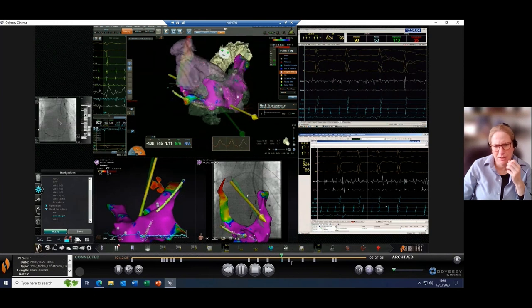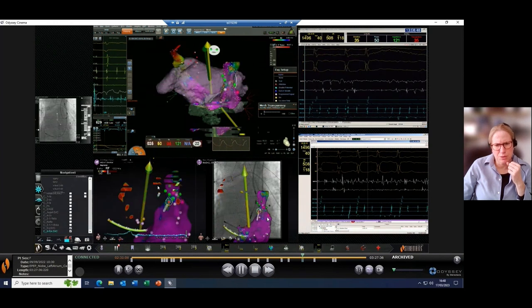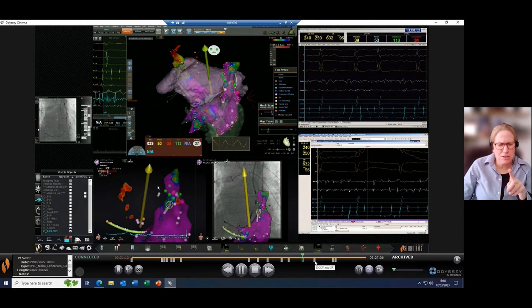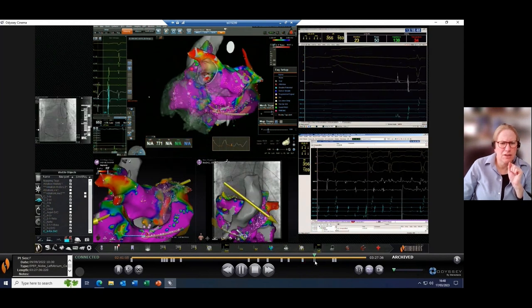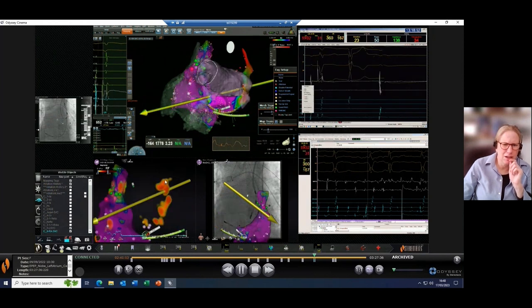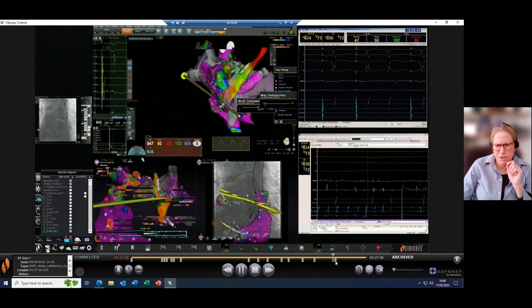And we elected to ablate here in the left SVC as well. I isolated the right SVC equally. Remember, this patient is left atrial isomerism, so there is no sinus node to mention, so there's an atrial escape. Eventually, we cardioverted this patient as she did not convert during any of our RF. And you can see again the ablation history here, ablation from endo and epicardially on the ridge. And finally, that was the end of the procedure.